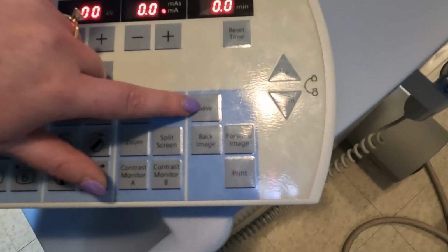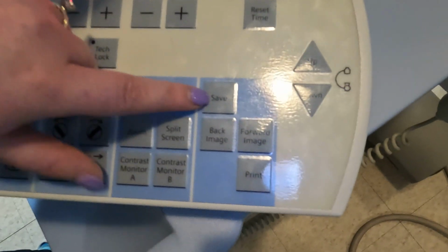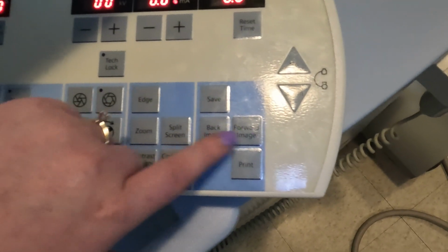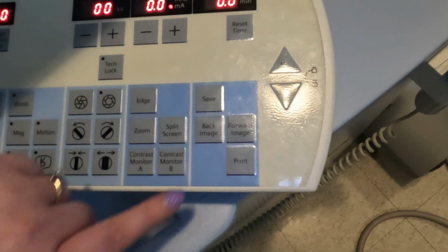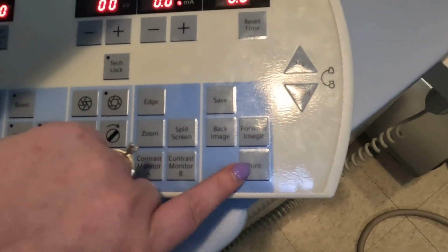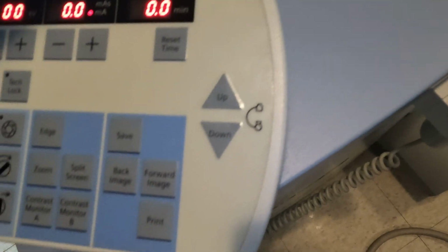This button here will save your image that you took. So if you took an AP or a lateral and you need to save your image, that's your save. And if you need to flip through your images on your C-arm, you can use these ones as well. We do not use print because we don't have a printer. This is another up and down option, just like the other side.